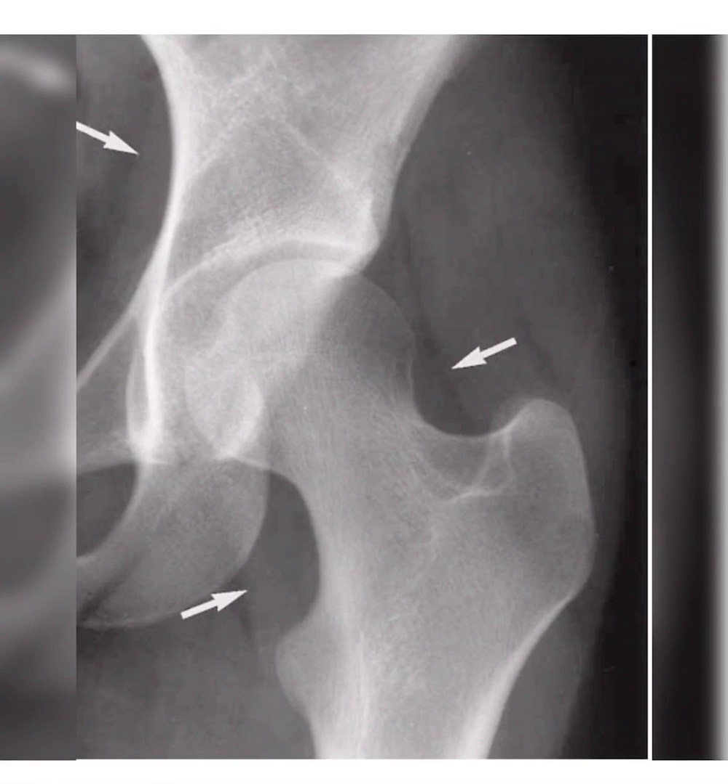As we see here in this AP left hip X-ray, we see the fat pads around the left hip. Here, this is the obturator fat pad, and here the iliopsoas fat pad, and here the gluteal fat pad.